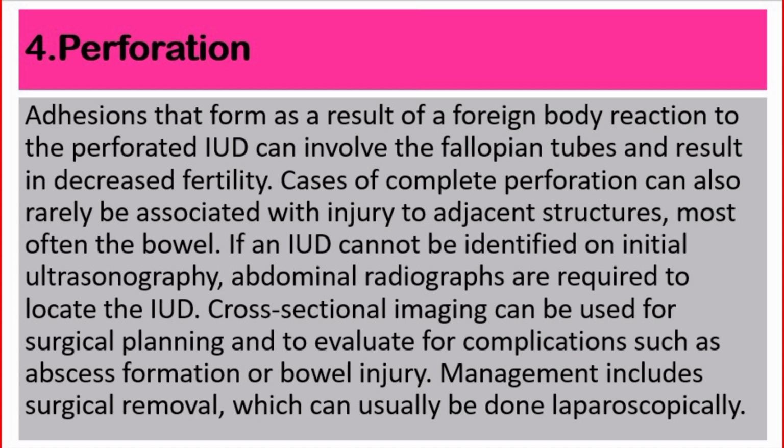If an IUD can't be identified on initial ultrasonography, abdominal radiographs are required to locate the IUD. Cross-sectional imaging can be used for surgical planning and to evaluate for complications such as abscess formation or bowel injury. Management includes surgical removal, which can usually be done laparoscopically.